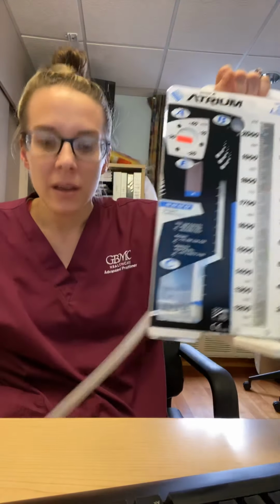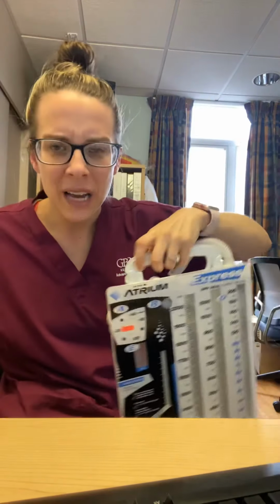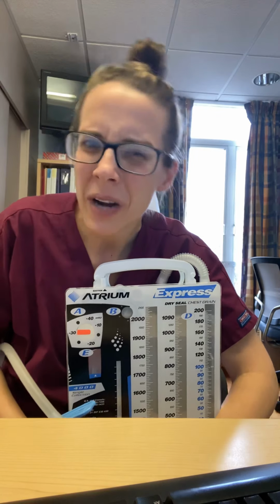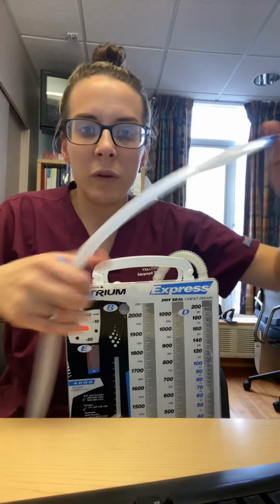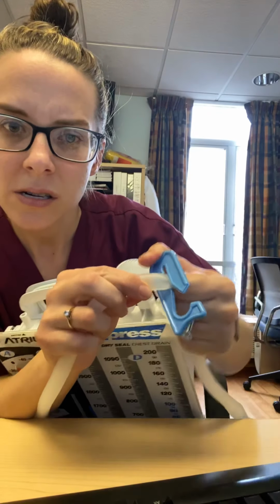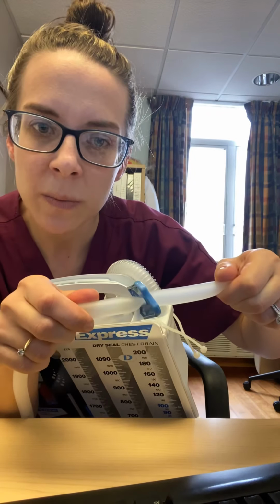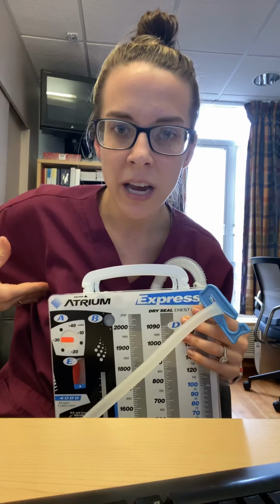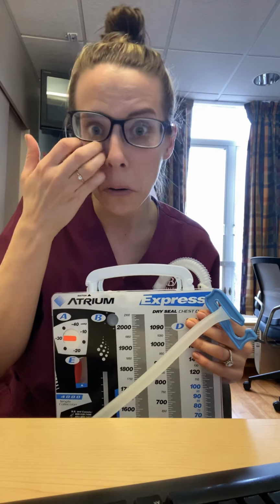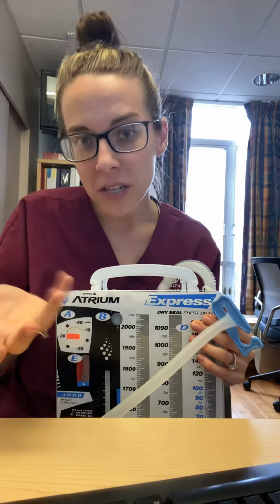Tube clamp. Where I worked, sometimes we would give patients a clamping trial. Like if we weren't sure, okay, it looks like the air leak is resolved, but we're not really sure. We would basically slide this clamp onto the Pleurovac tubing. So now it's basically like you have a chest tube in the patient, but you're not really using it. You're basically seeing if the patient can tolerate not having the chest tube function.